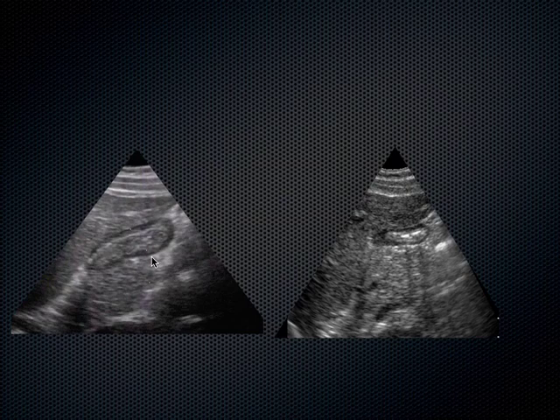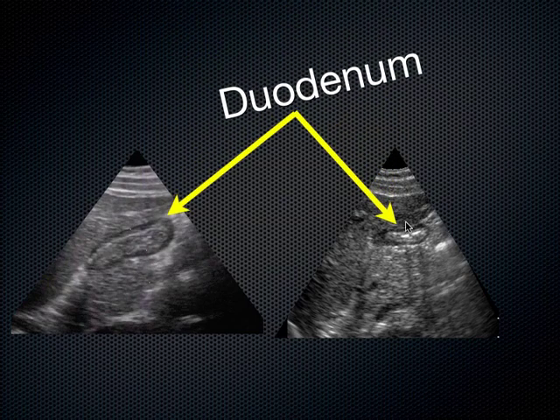Specifically, it's the duodenum. We can see the duodenum sometimes during mid-peristalsis when it's contracted down on itself, and when there's air in the duodenum casting shadows, and that duodenum is right next to the gallbladder, it's easy to mistake a normal duodenum for having gallstones, for looking like a WES sign sometimes.